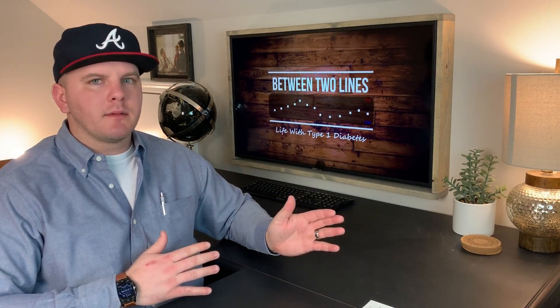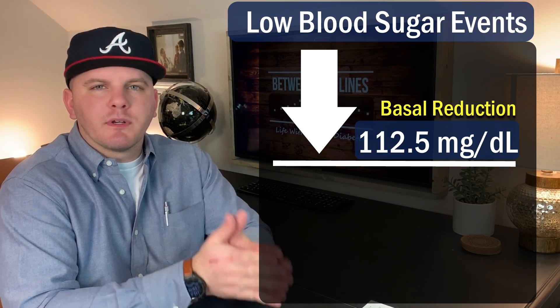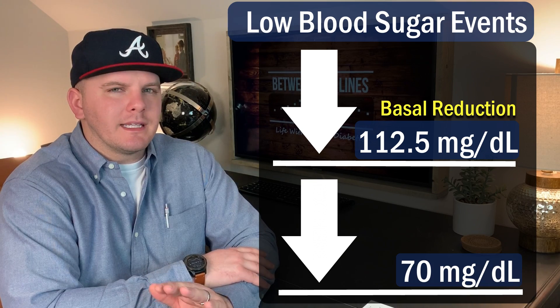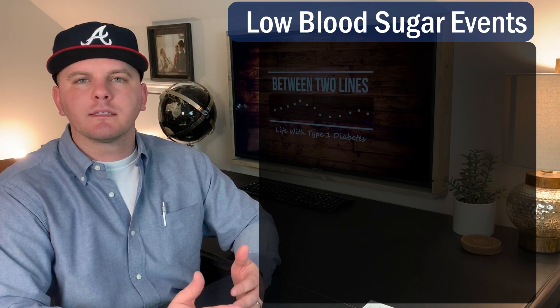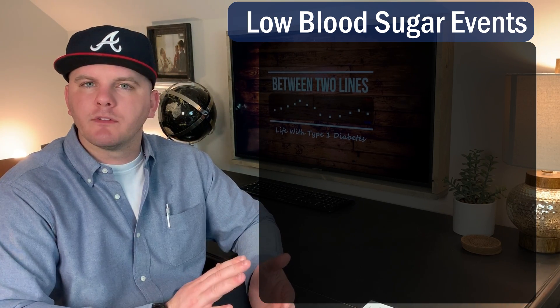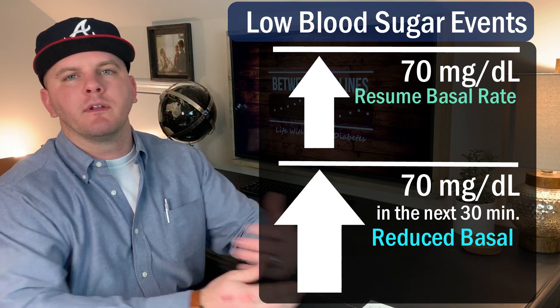Here's the skeleton of what Control IQ will do. You need both the Dexcom CGM and the Tandem pump linked together. When it sees your readings show you're on your way down and you're going to hit 112.5 mg/dL in the next 30 minutes, it will start to scale back your basal rate. If you continue to drop and it predicts you'll go below 70 in the next 30 minutes, it will discontinue your basal rate altogether. Once you've treated a low and your blood sugar starts rising, it won't immediately resume basal. When it sees you're going to hit 70 in the next 30 minutes it will reincorporate basal at reduced capacity, and only when you actually hit 70 on the way back up will it introduce full basal rate.